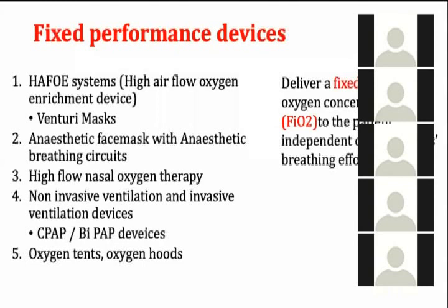Pavita, okay. And there's a thing called peak inspiratory flow. When you supply oxygen, just say you are giving 4 liters per minute of oxygen through a device which consists of 100% oxygen, isn't it? When you're giving oxygen, that is pure oxygen that you're giving. So just think about this peak inspiratory flow, which I said is about 25 to 30 liters per minute.